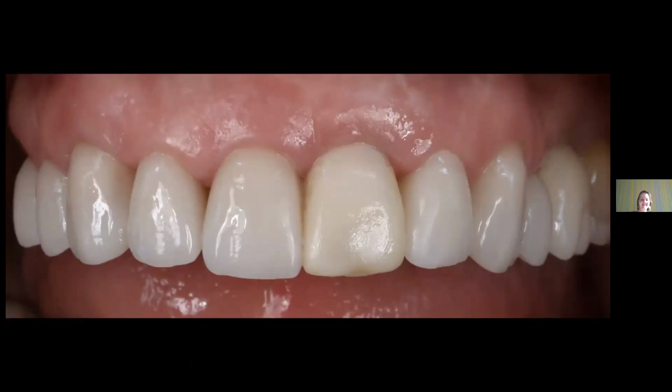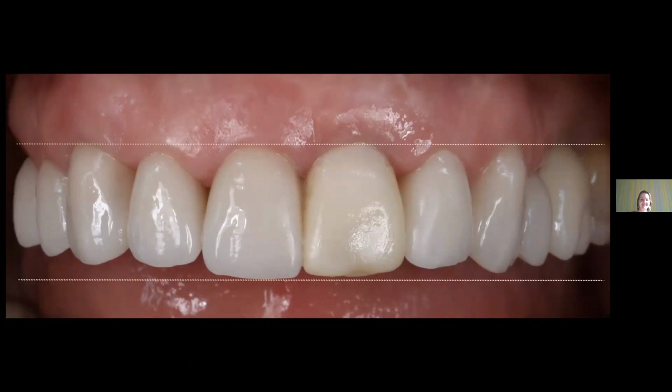So the concept is very, very similar. If you look at this case, it was almost like magic. No surgery, just changing prosthetic elements. And we were changing prosthetic elements from a tooth and an implant, but we had the same impact. So yeah, it was a super interesting case that really made me understand that these biologically orientated preparations were a much healthier way to treat teeth with all ceramic restorations, full coverage restorations.